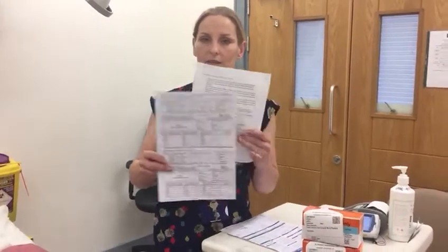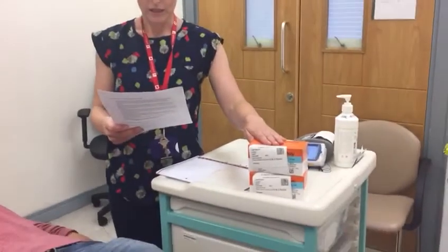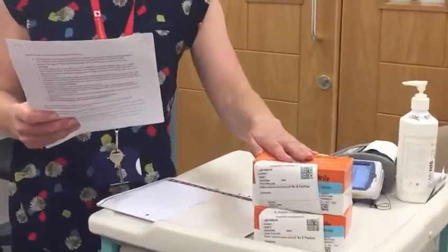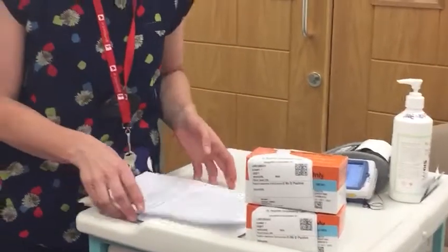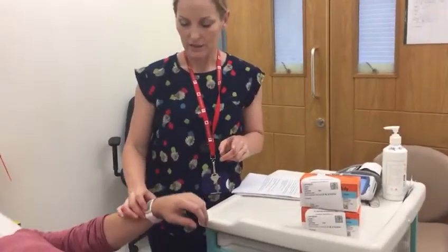The requesting team must prescribe the PCC in the record of transfusion. On issuing, you can scan out the PCC from the kiosk in Blood Bank and complete batch kiosk collection checks as per procedure. On return to the clinical area, perform pre-administration bedside checks at the patient's bedside.